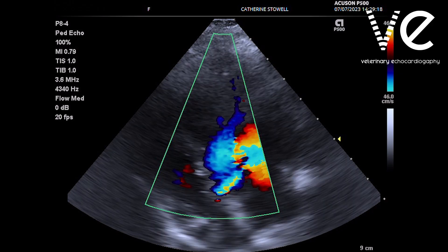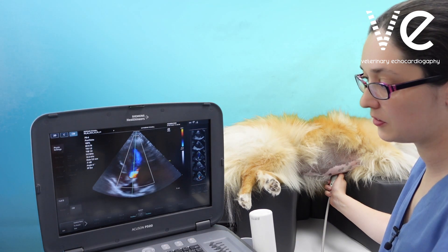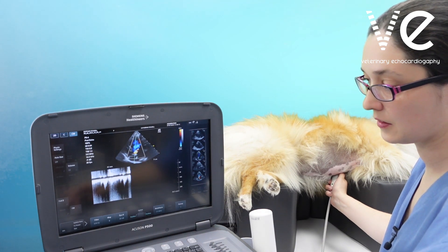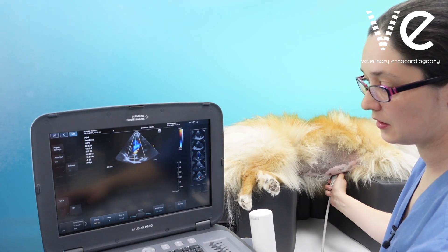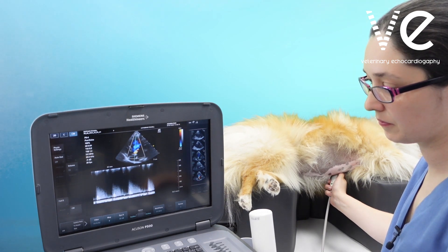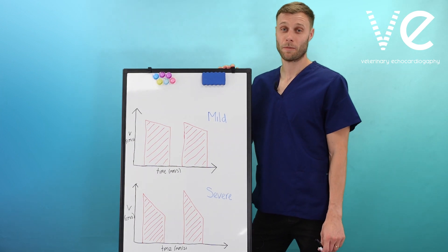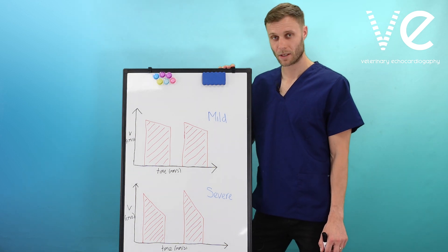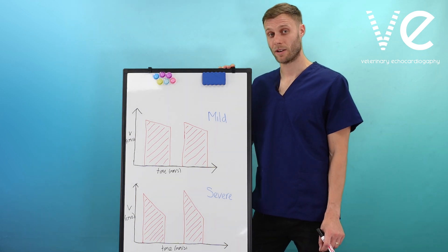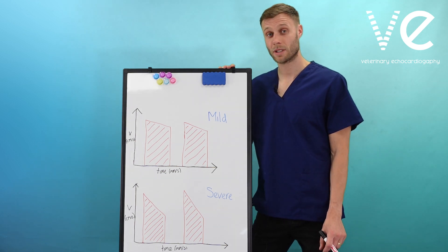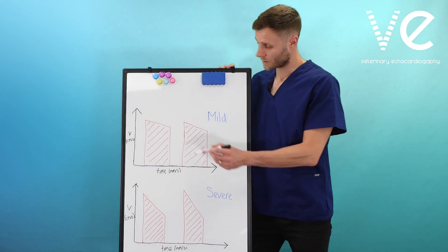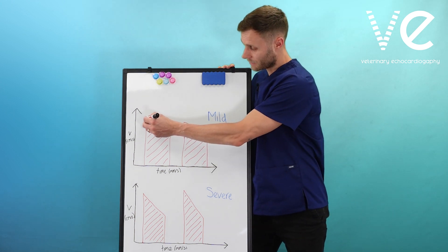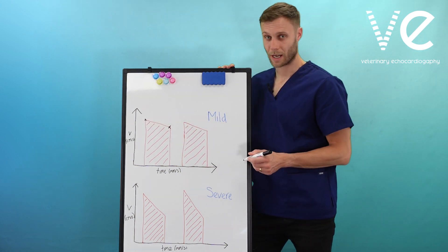Getting as good alignment as possible, place your continuous wave Doppler beam straight down. Bring your baseline down and optimize your scale. Once you've obtained the Doppler through your regurgitant jet, you can measure a pressure half-time to assess the severity. If there is a small orifice area of aortic regurgitation, the pressures between the aorta and left ventricle will equalise gradually, giving a more gradual deceleration slope. You measure from this point to this point to get your pressure half-time.